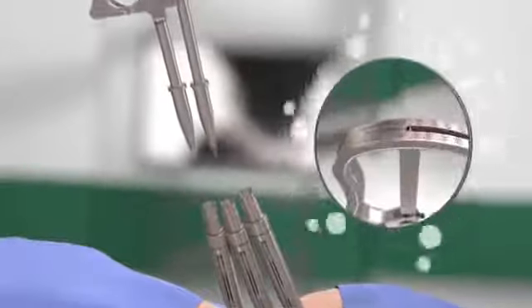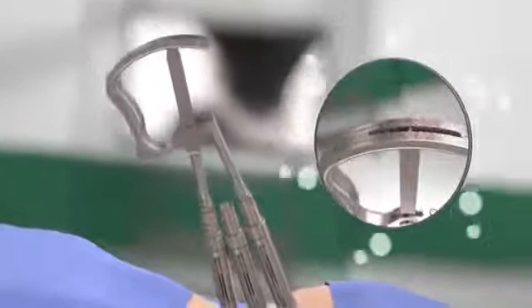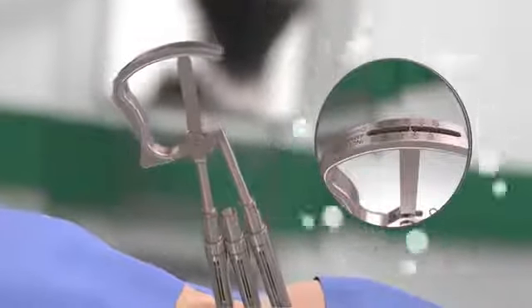Once tissue dissection has occurred, insert the rod measuring tool to determine the correct rod length.